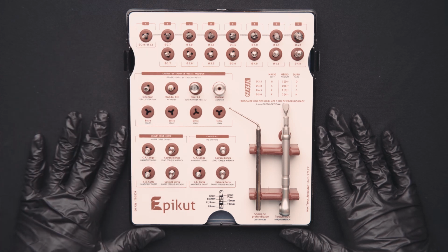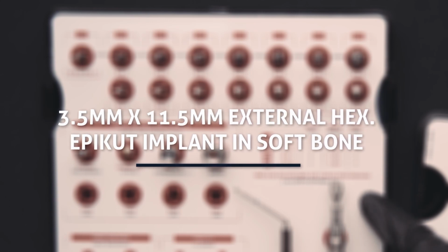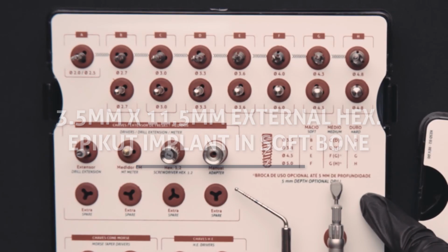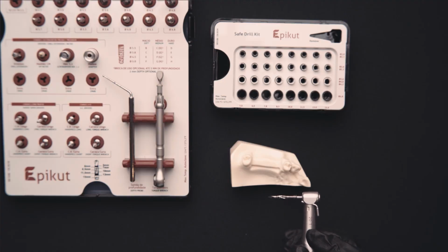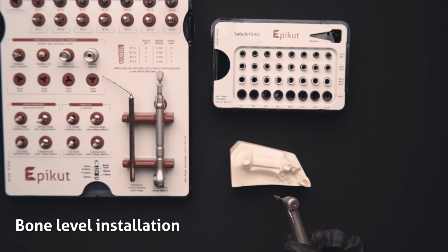Exemplifying with the drilling sequence of a 3.5 mm diameter implant, external hexagon connection, length of 11.5 mm in soft bone. Starting the drilling sequence of the Epikut implant, external hexagon, 3.5 mm by 11.5 mm. As an external hexagon implant, it has indication for bone level installation. It has a length of 11.5 mm.